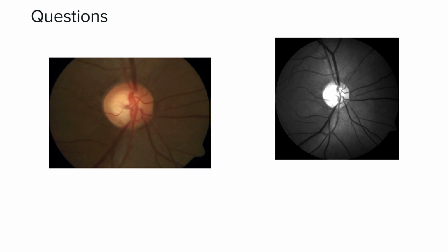So whenever you see a rim thinning or a notching in that area, you should always look for an RNFL defect and see whether it is slit or wedge shaped, what kind of a defect it is, and immediately look at the opposite side for the RNFL defect. Even though the rim may look normal, you may start having some RNFL defect there in the initial period. Sometimes those defects may be a little away from the disc also, rarely. So you should always look for both the poles. That's where the RNFL defects start.